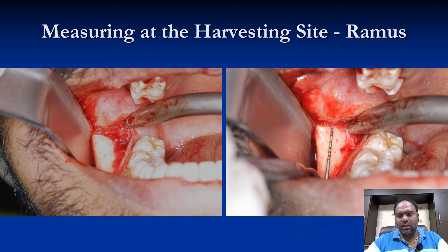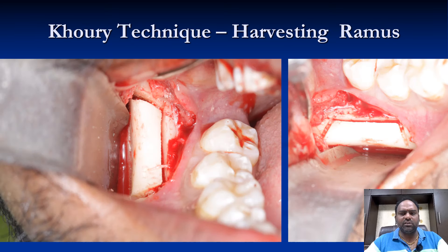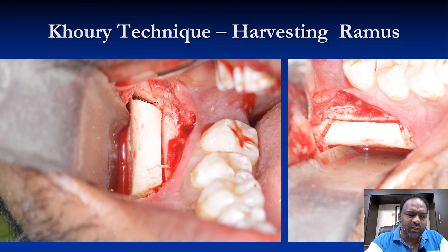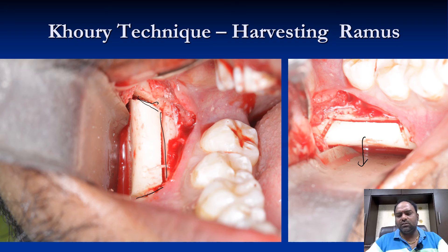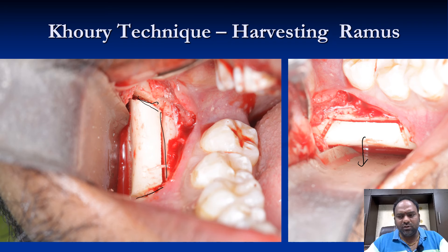We proceeded into the ramus for graft harvesting — which had already been informed to the patient and written consent was taken. We measured the ramus and then harvested the block. Whenever I harvest a ramus graft, I do it at a 45-degree angulation so it comes out easily. The ramus gives quite a good amount of bone compared to the chin or symphysis.